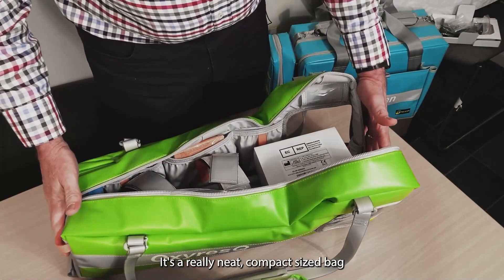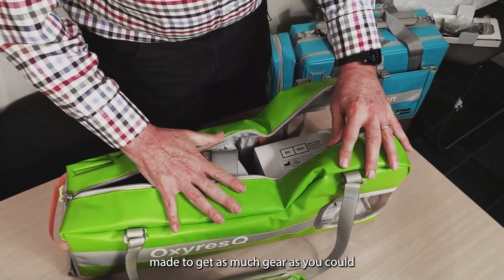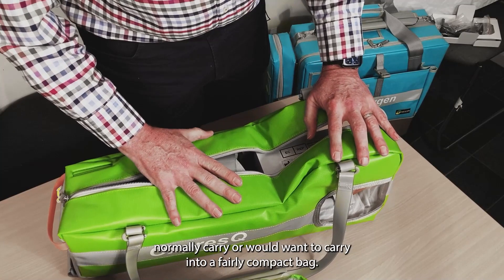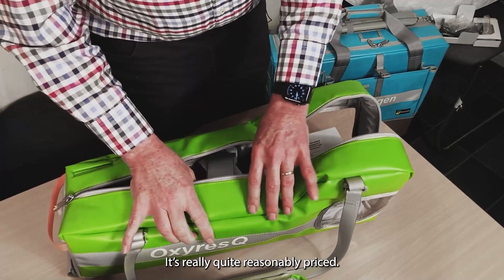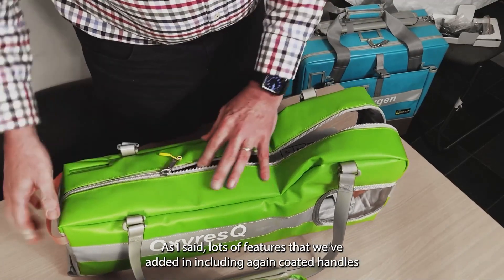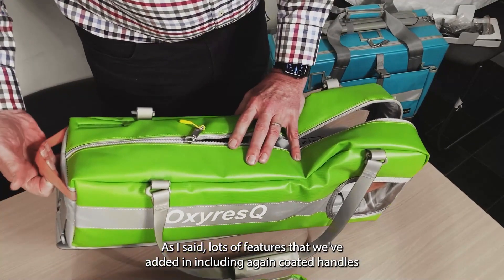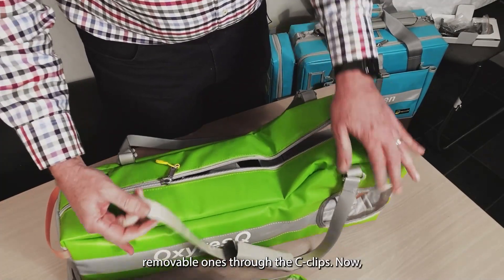It's a really neat, compact-size bag made to get as much gear as you could normally carry into a fairly compact bag. Really quite reasonably priced, with lots of features added in — including coated handles and removable ones through the C-clips.